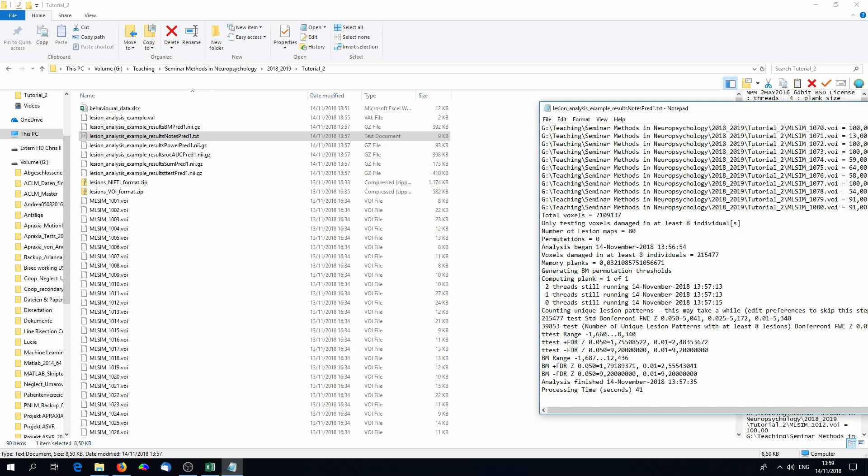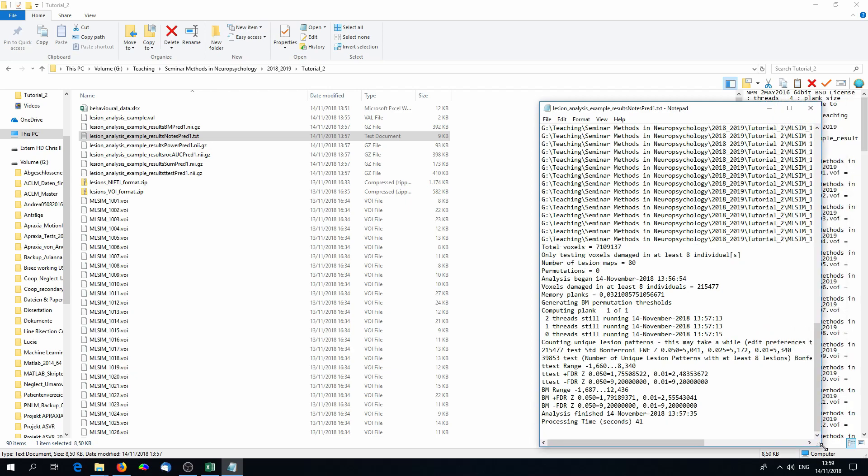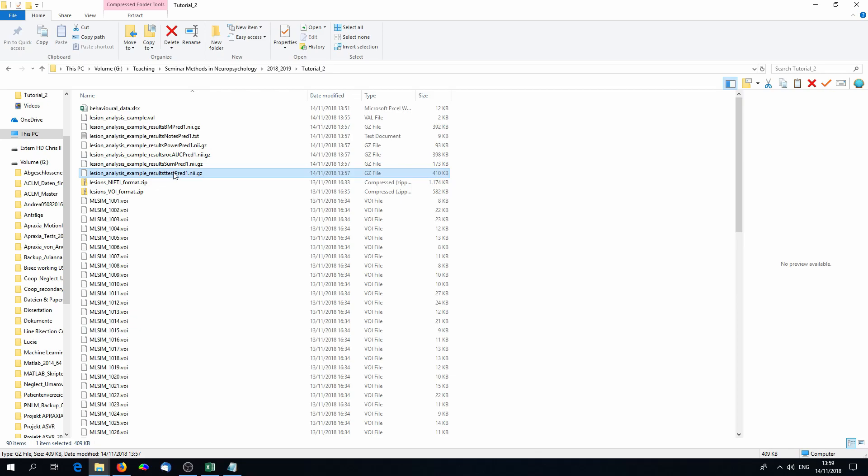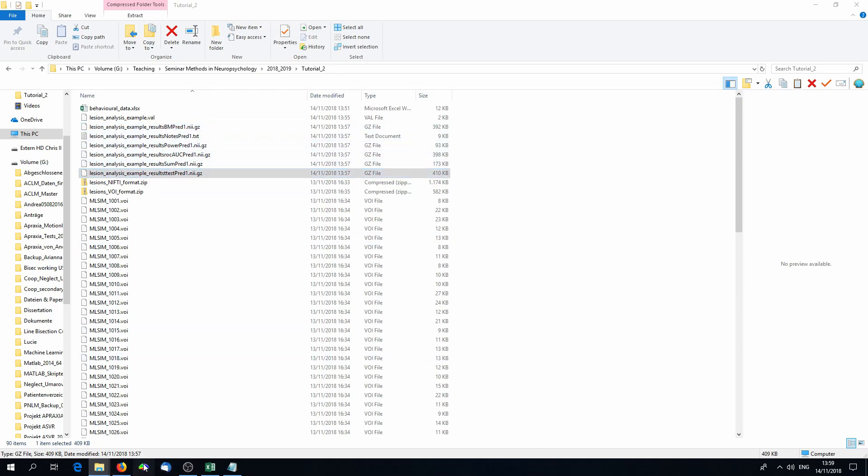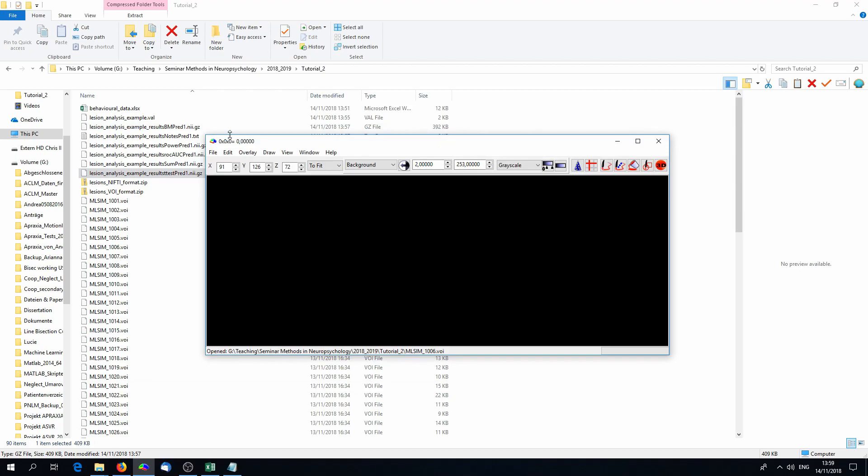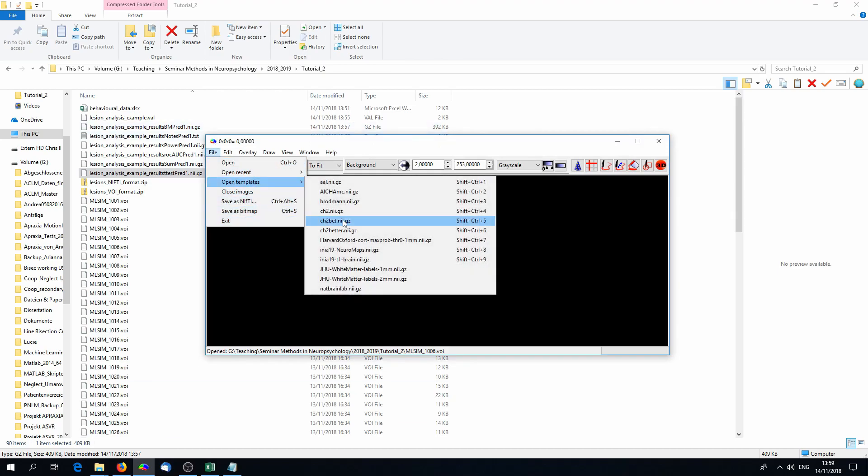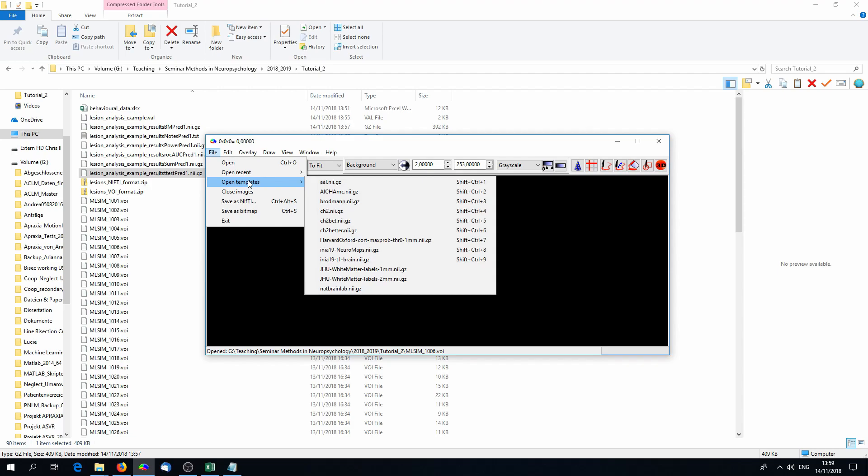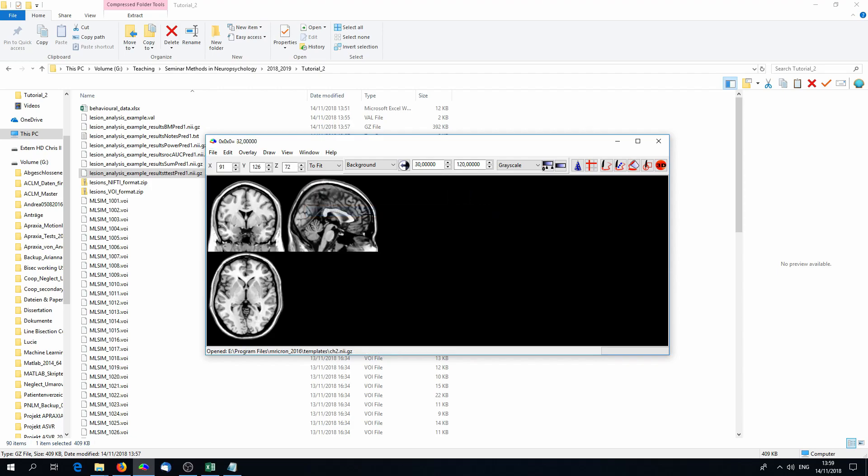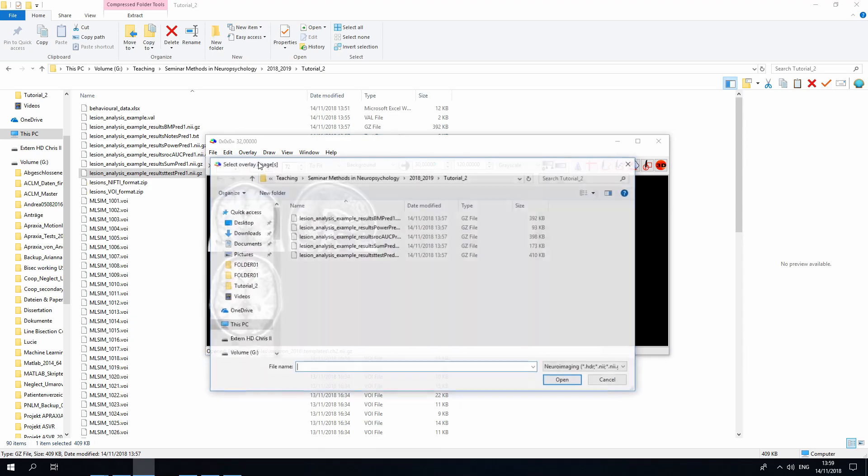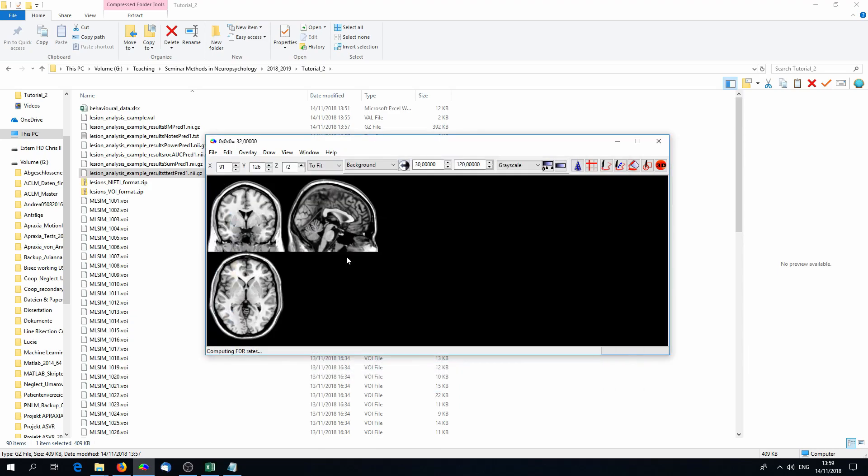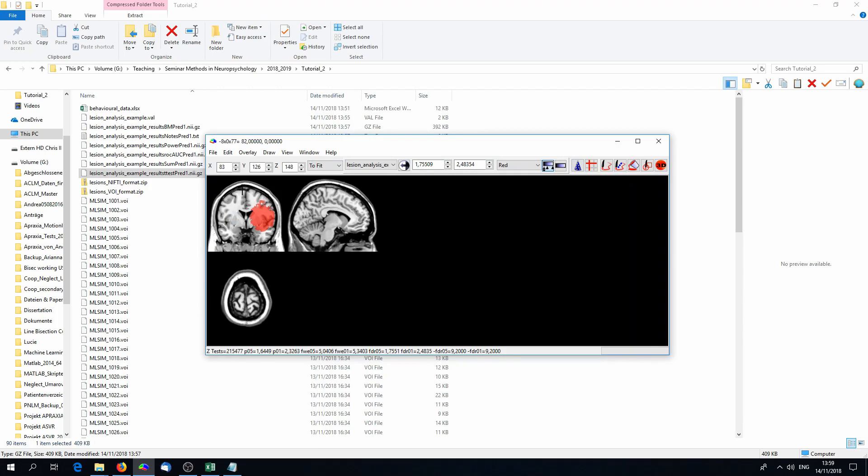We'll see soon what it means. First of all, we open one of these images. Let's start with the t-test image, and we open it in MRI-cron. Click on File, Open Template, CH2, to open a background template. And then on Overlay, Add, and choose the results t-test file. And here we have the statistical map.